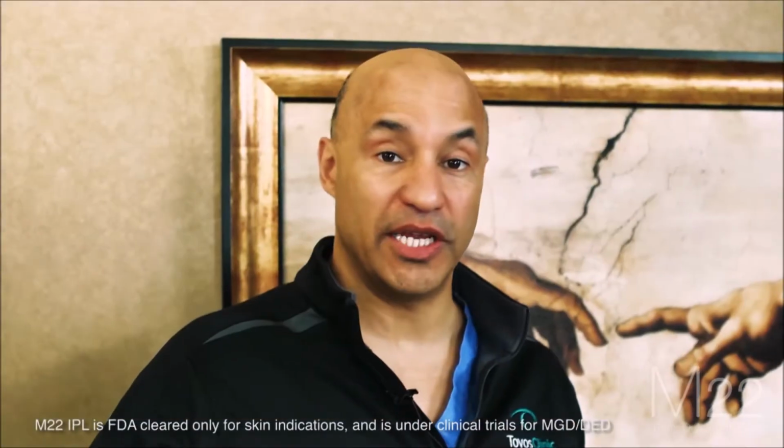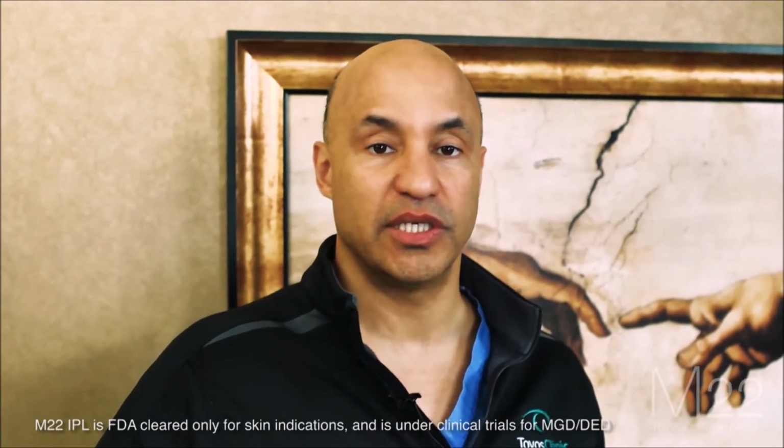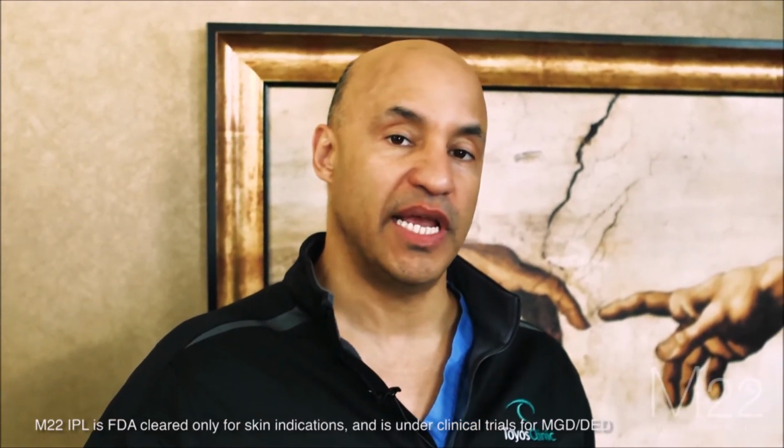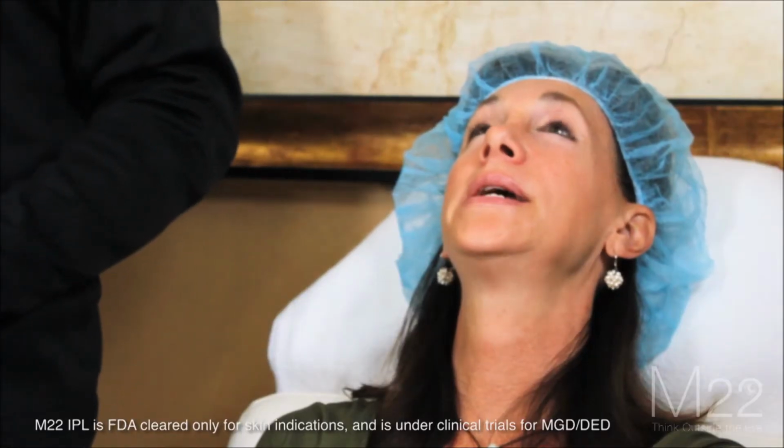So here we are with the patient and we're about to treat. The main question I ask patients is, if they're Fitzpatrick 1 through 3, I ask them if they tan or they burn when they get sun. Do you tan or do you burn when you get sun? I tan. Tan. So if a patient tans, then we're going to lower the energy level.